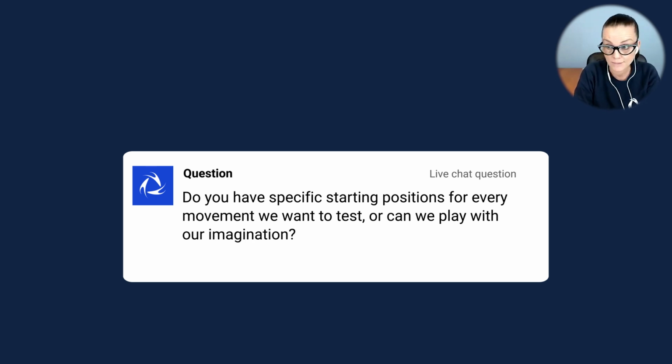But in terms of the processing phase, pay attention that what we have just shown during the video, the elaboration, is related to the functional movements of lateral bending, flexion-extension, and rotation. You have to take into account that the elaboration is very close to the type of movement that you are performing. So if you change the acquisition, maybe you also have to modify something in the processing phase.